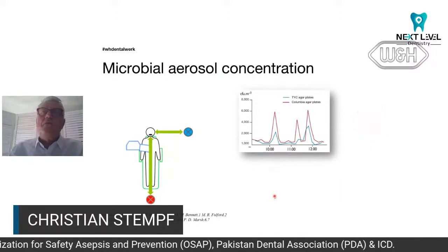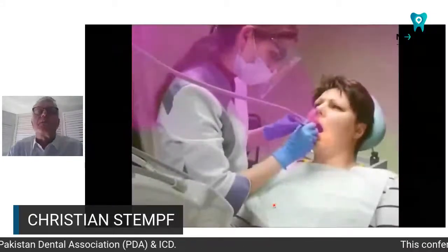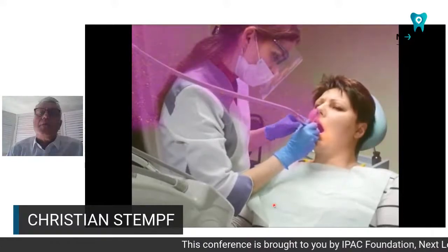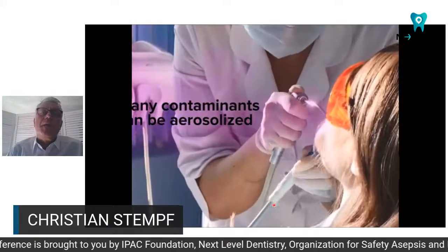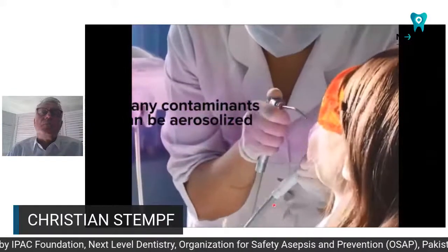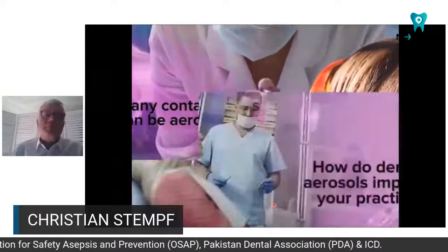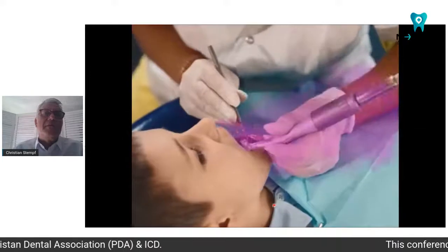Short video to illustrate what I was just saying. Following on this, I'm going to show you what the handpiece does. Just note that the doctor has not covered his nose.